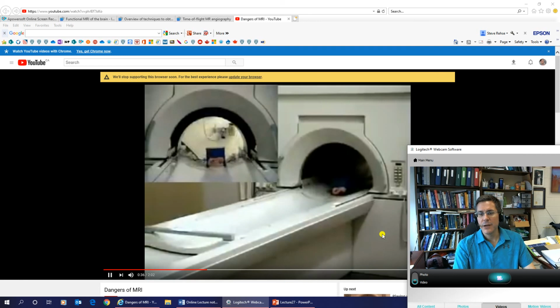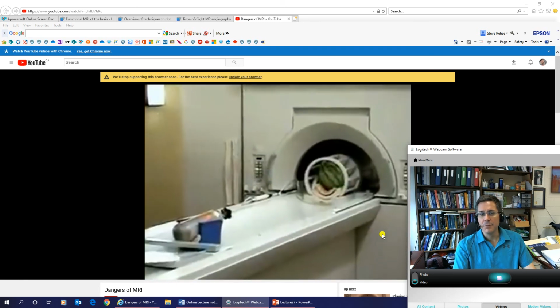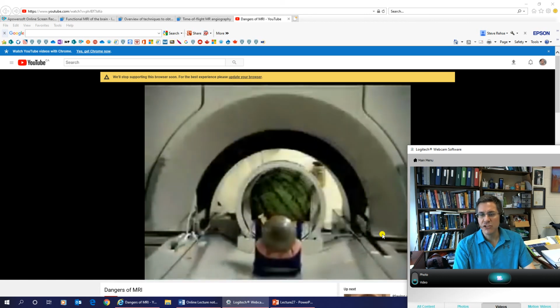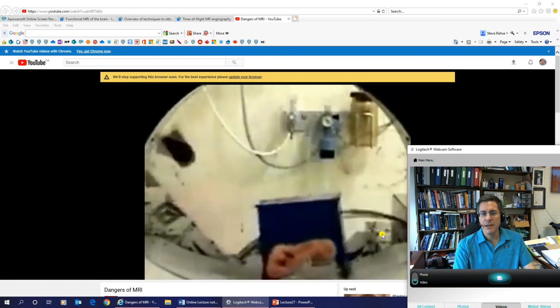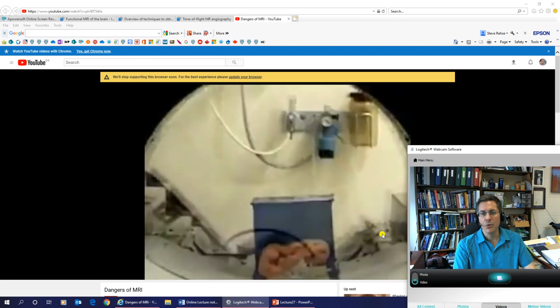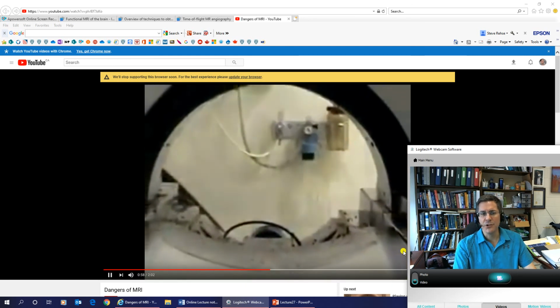Wham! Okay, well, that's a dead patient if you're not careful. Everything turns into a projectile: wrenches, surgical apparatus, scissors, anything that's magnetic, you wouldn't even know it. You come in, you won't be able to hold it, it'll get torn out of your hand into the bore of the MR. There's a bunch of videos on YouTube of stuff like this.